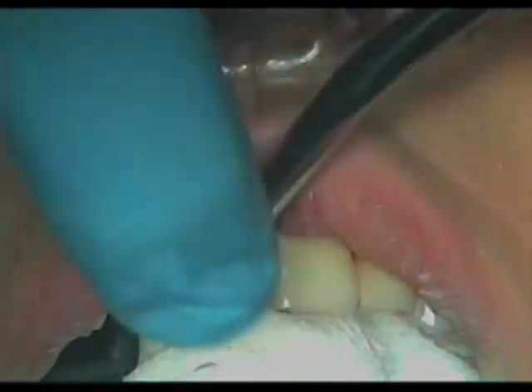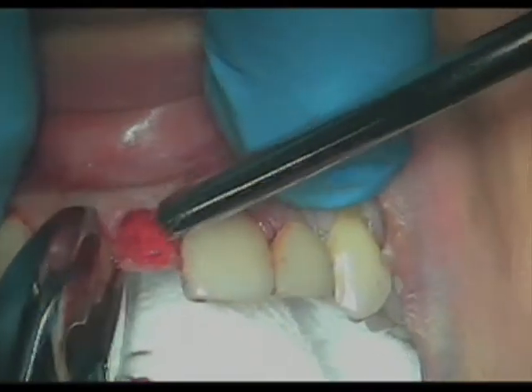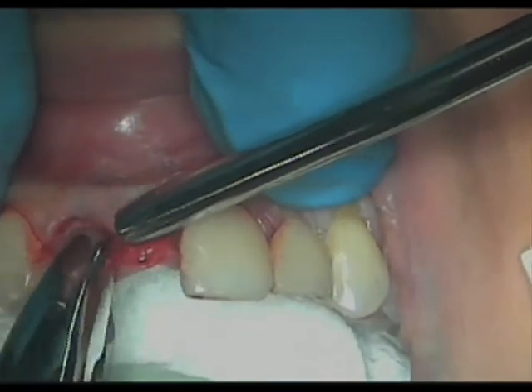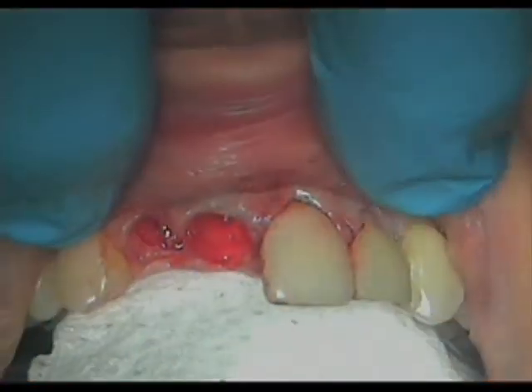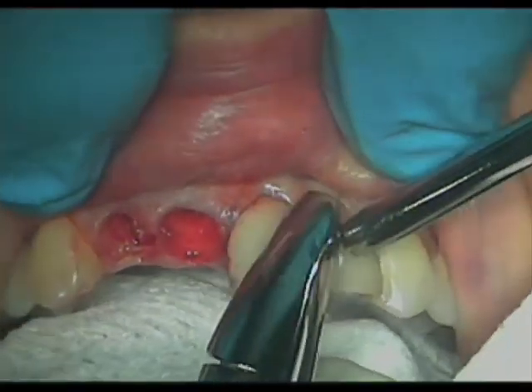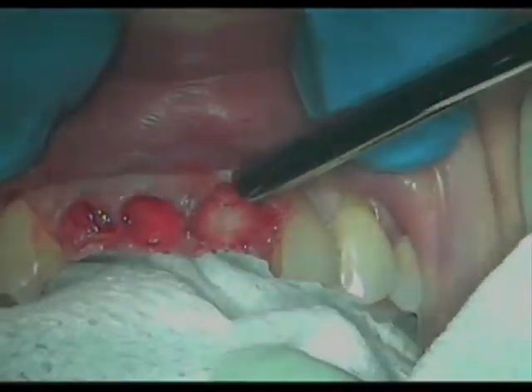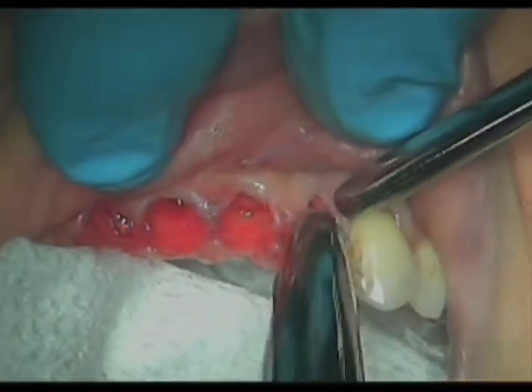We have a nice clean extraction, trying to, again, maintain the interdental papilla as possible. We're simply removing those 4 mobile anterior teeth with the shortened roots, and you can see I'm not having any difficulty at all simply removing these teeth. We will not use a scalpel in this situation. Again, we're trying to maintain that interdental papilla as much as possible to maintain our final aesthetic results.